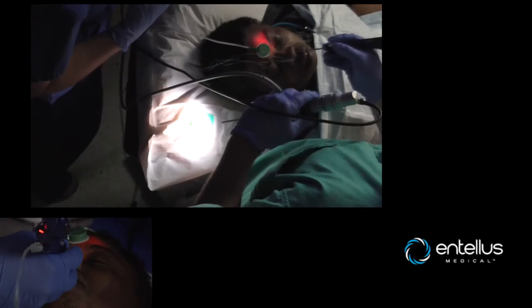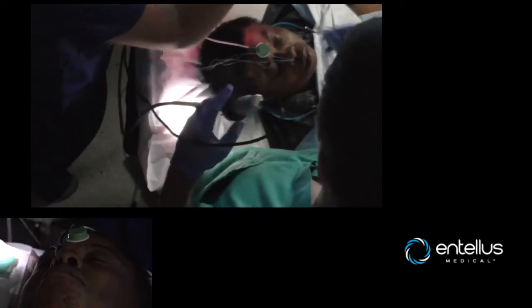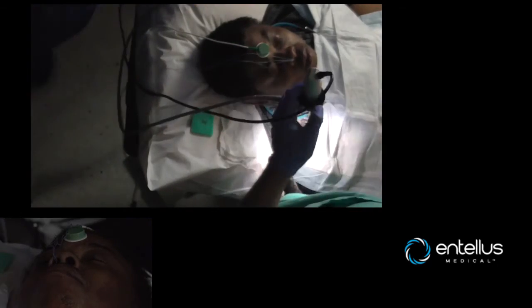Now if you look at our excursion — greatly improved. So we're going to place a pledget and we're going to go to the other sinus.